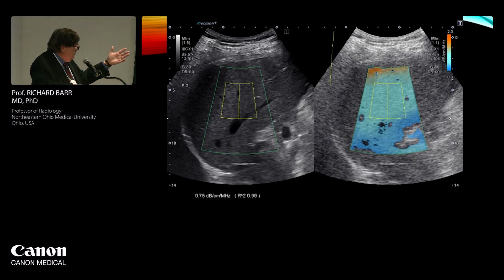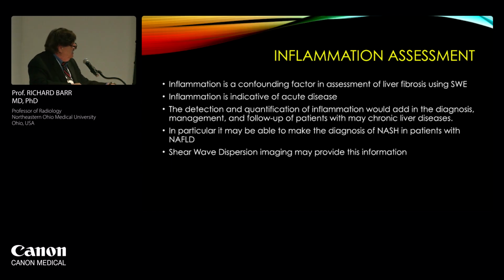And again, I don't want to go over this in detail, but this is basically what we see, and hopefully this pointer works. So we're putting in this big box, but we put in this box, which is measuring the attenuation, and we get a value out, and we also get a score that tells us about the quality of the exam, and I think Dr. Ferrioli is going to go over that in a lot more detail.